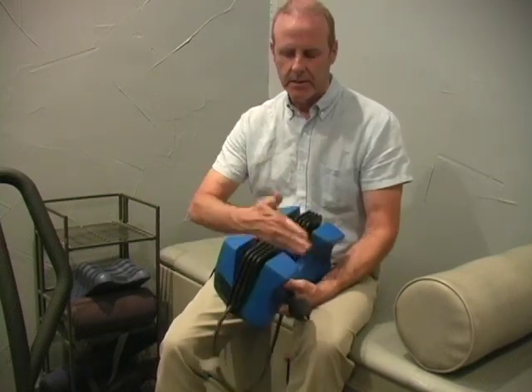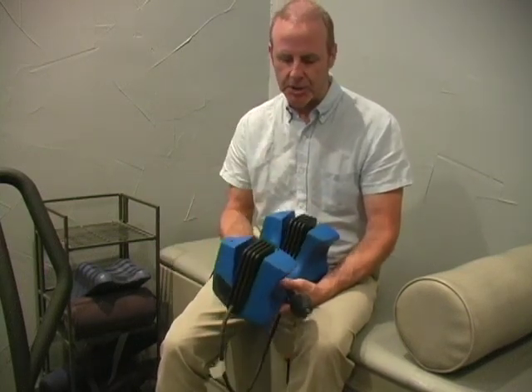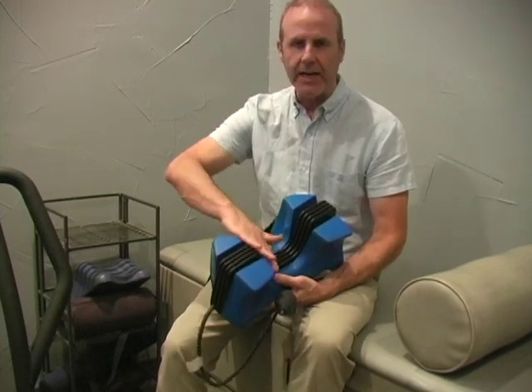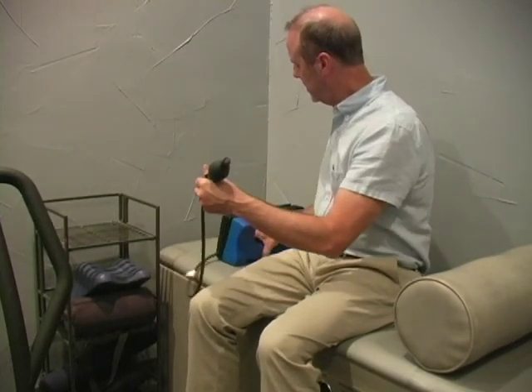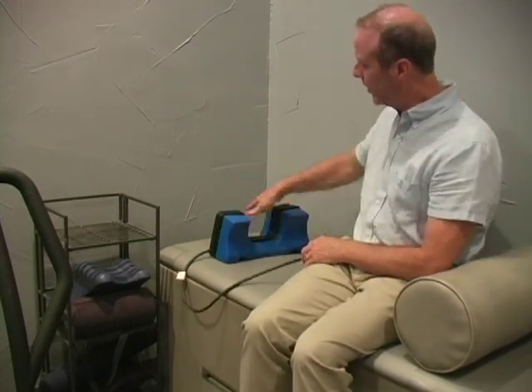This is the Pro-Nex cervical traction device. The neck is cradled in this area. Lay it flat. You're going to lie back so the neck is going to be cradled right here, and the back of the head is going to fall here.